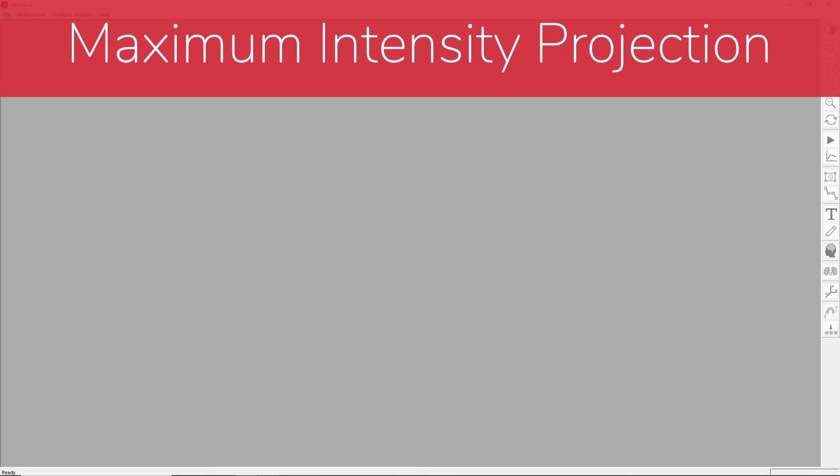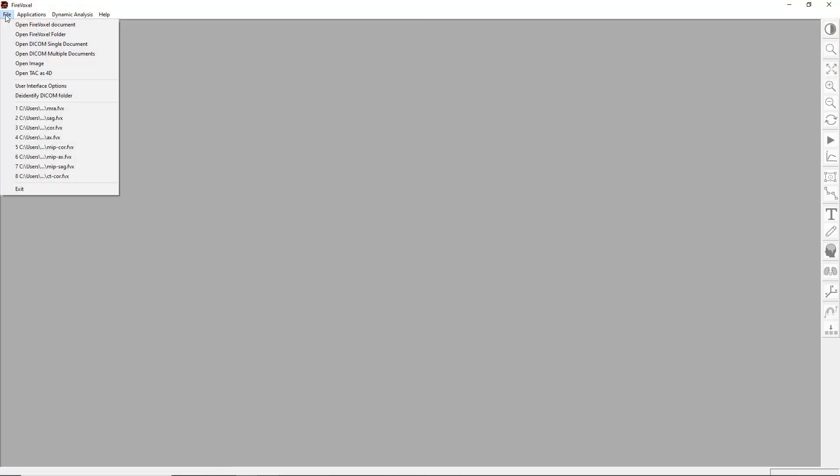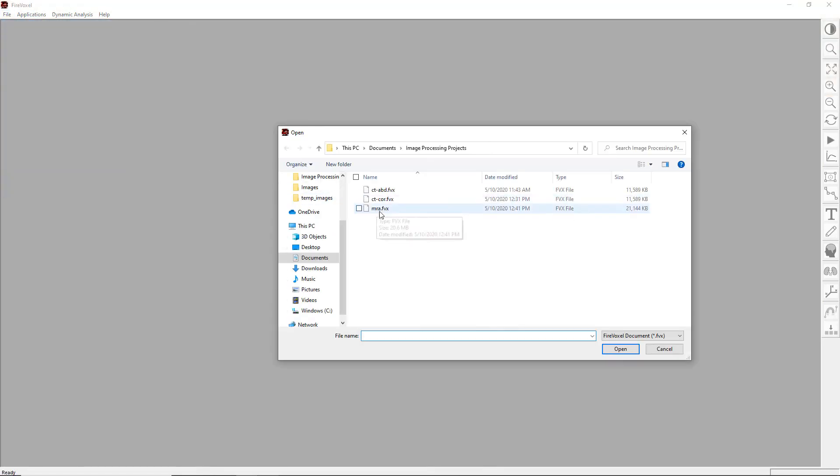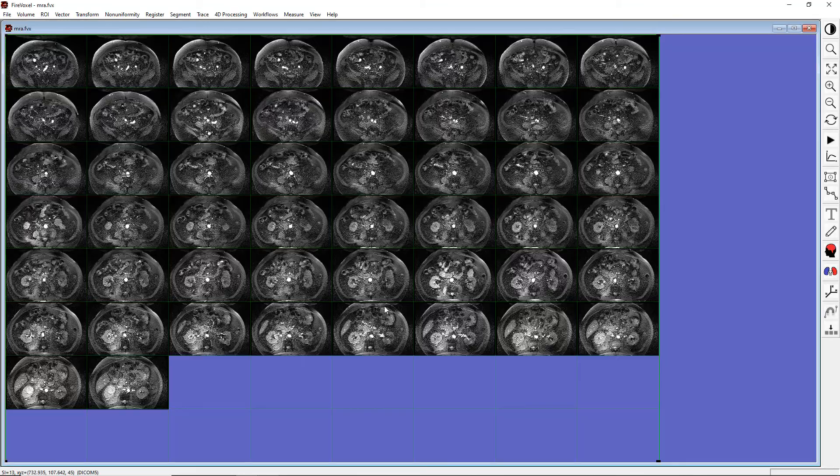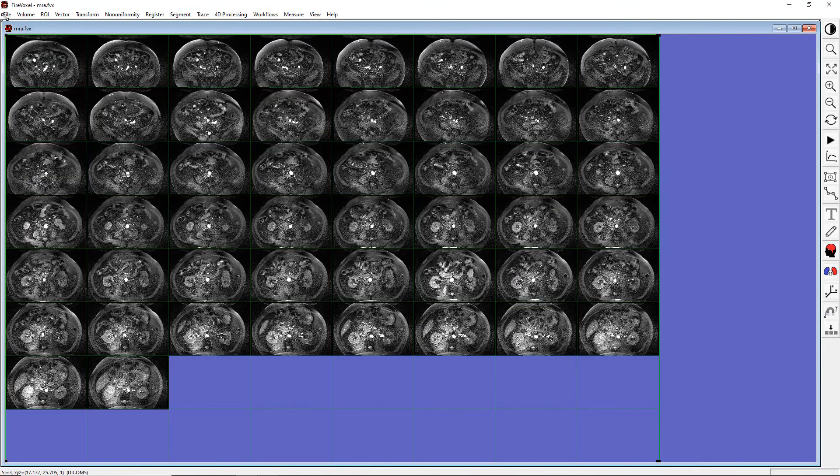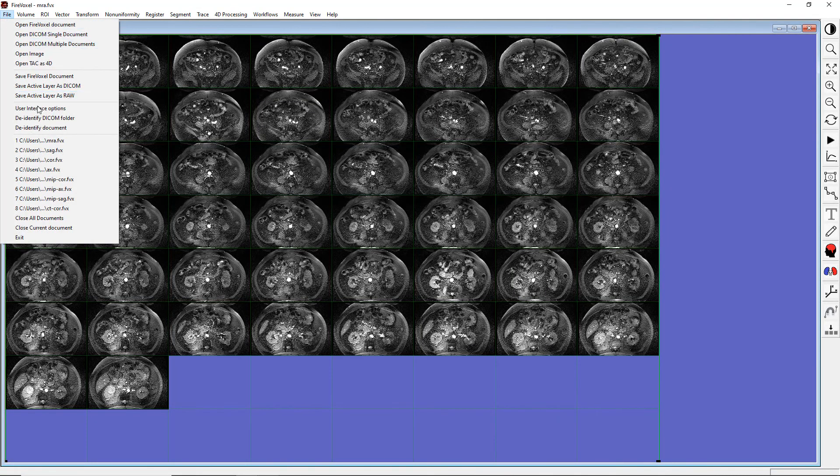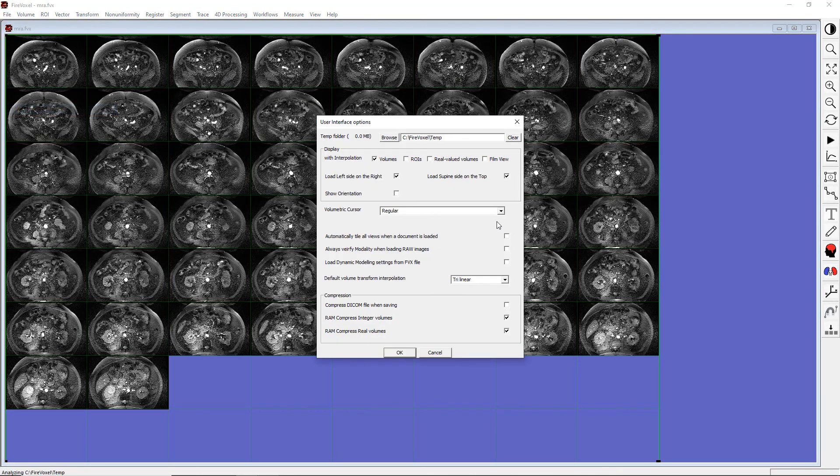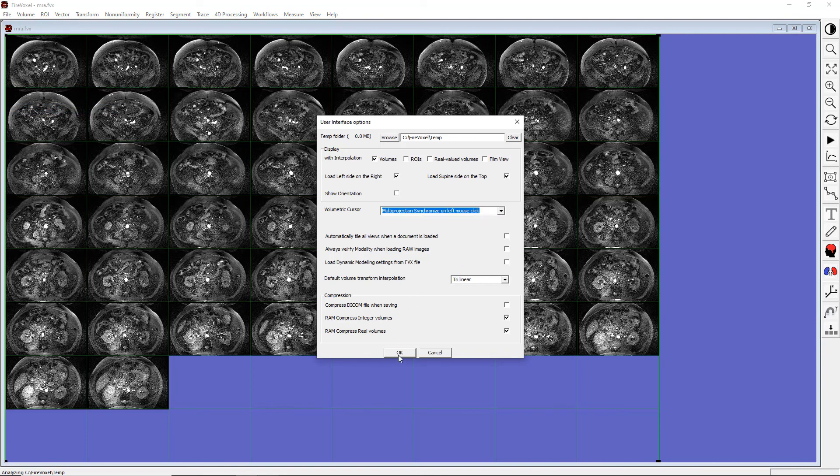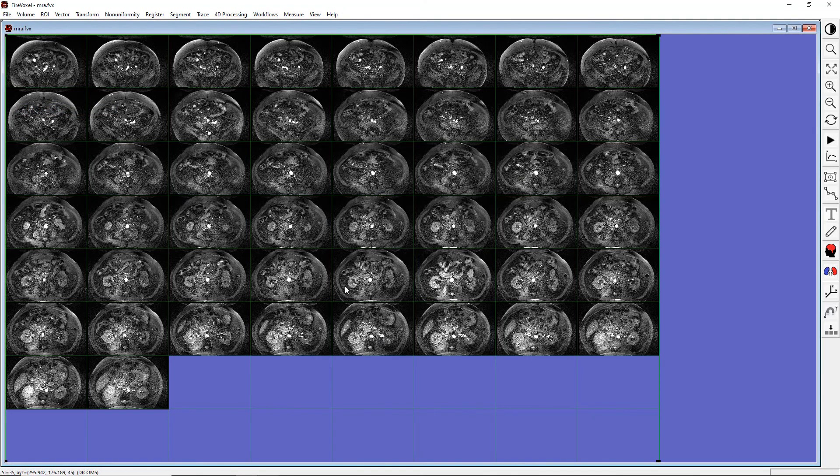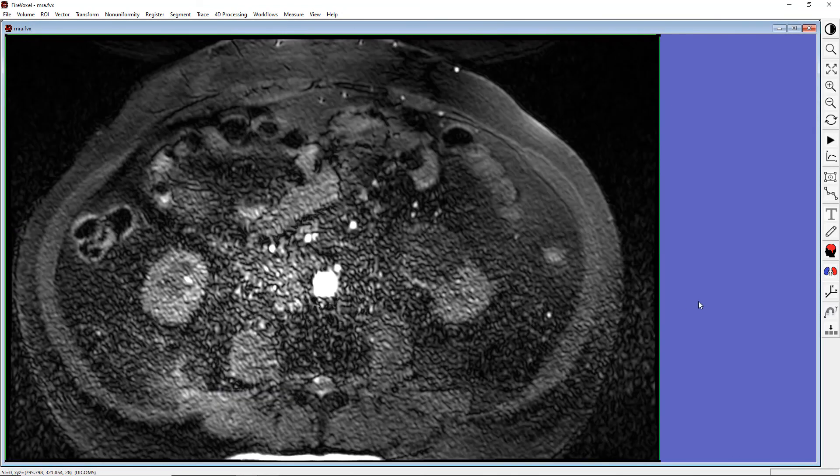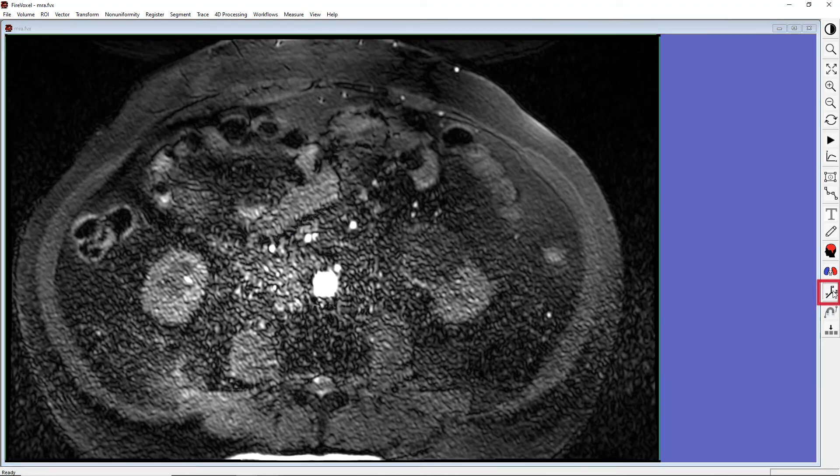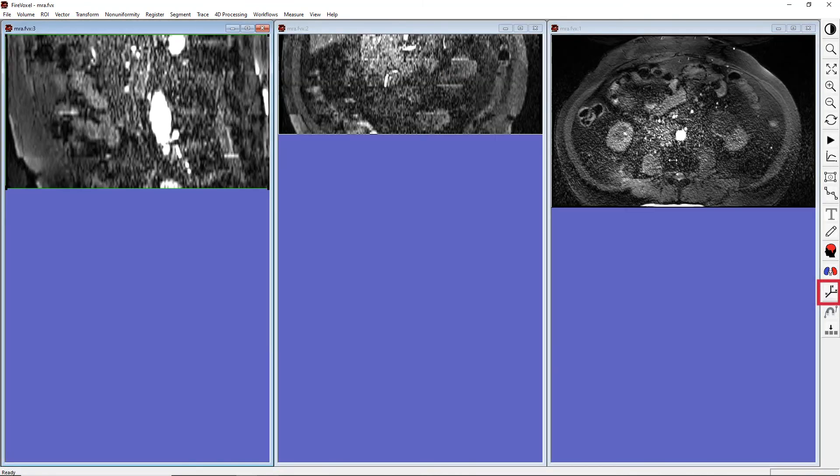Now, let's explore other viewing options, such as the maximum intensity projection. Let's open a document with axial abdominal MR angiography images. And just for convenience, let's reactivate the crosshair. Now, let's click Display Orthogonal Projections to show the other views.